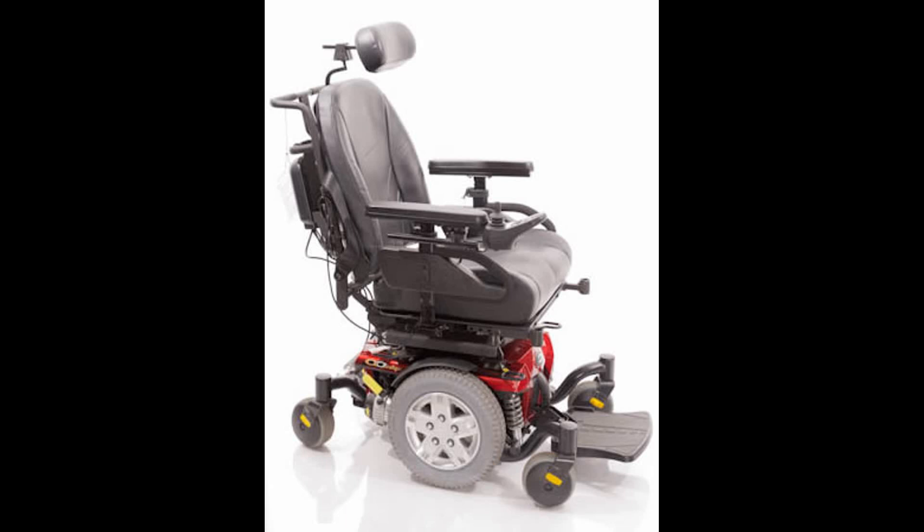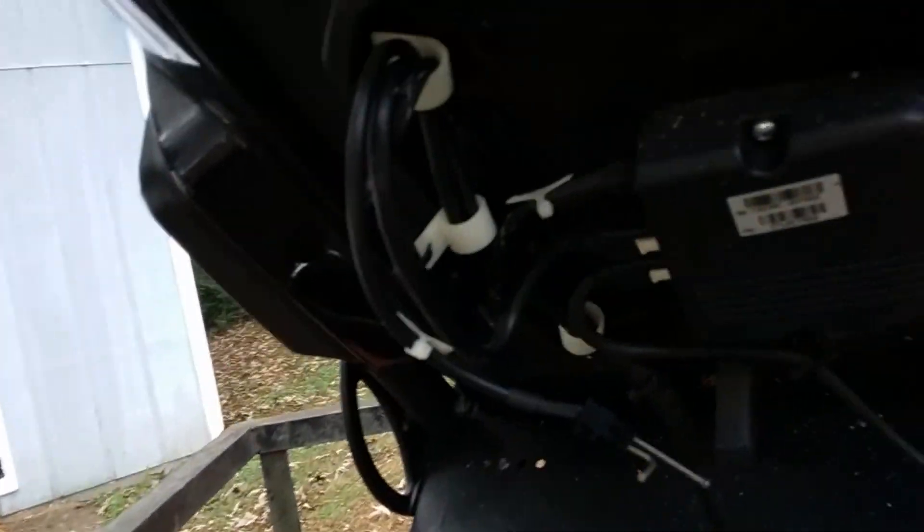I originally was not going to make a video on this, but then I used my phone and recorded part of it, so I just want to show you what I was able to do. It might give you some ideas on how to repair yours if you ever have a problem with it.